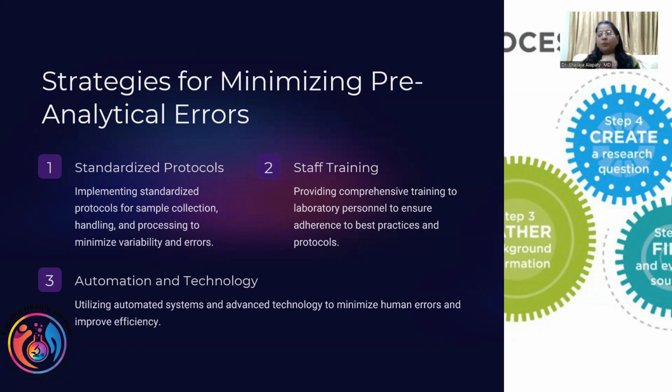For example, you're putting a barcode. You need to put the barcode of the patient on the tube. One person will put the barcode straight. One person will put it at an angle. One person will wrap it around the tube. One person will put it on the cap. But if it's done like that, how are we going to scan the barcode? So in order to teach them, we don't have to just tell them, put the barcode. We need to teach them, you need to put the barcode straight. The reason you need to put the barcode straight is because only then can we scan it and get the number. Now, if you put it across like this, the scanner will not take it. If you wrap it around, the scanner will not take it. If you put it on top of the tube, it will not take it, unless you tell them.